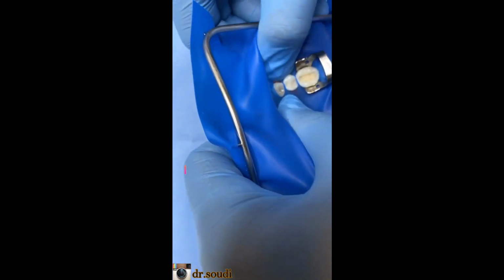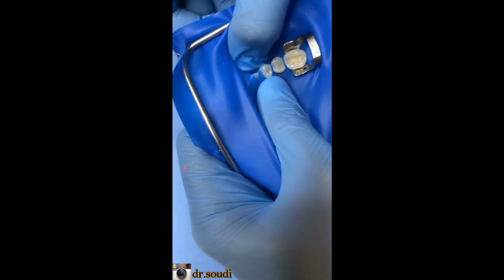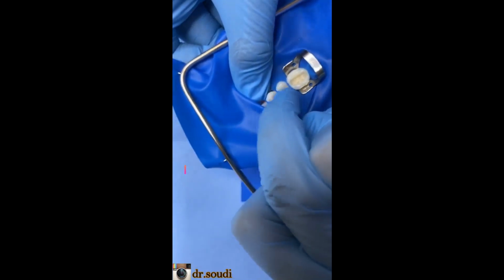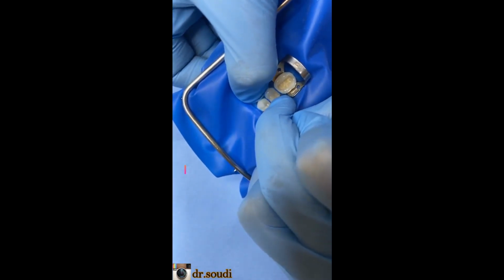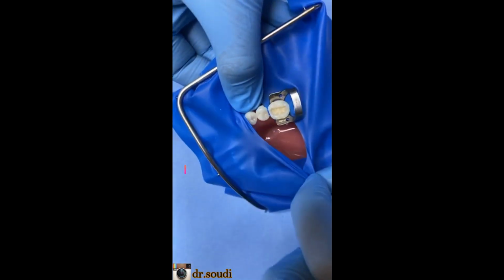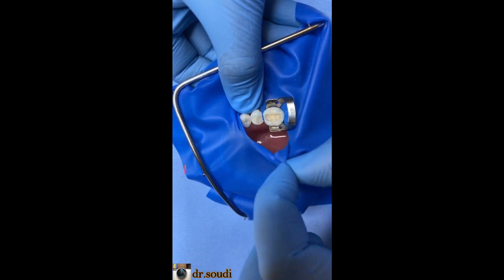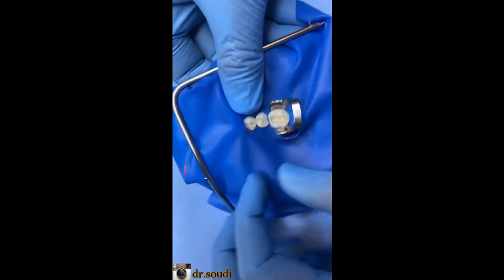If you have tight contact, it will be very difficult. You will have to have an assistant. And sorry, I don't have an assistant now. Okay, you press it like this to pass it. If you press too much, you will get this. If you don't test your contact, you will get this, because we have a tight contact here. We said we have tight contact here.